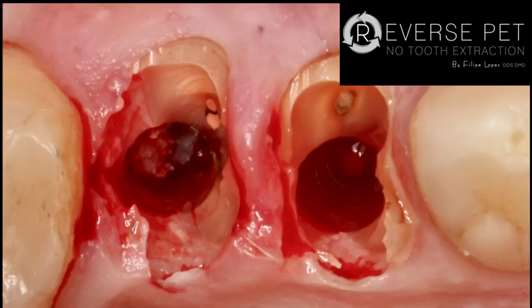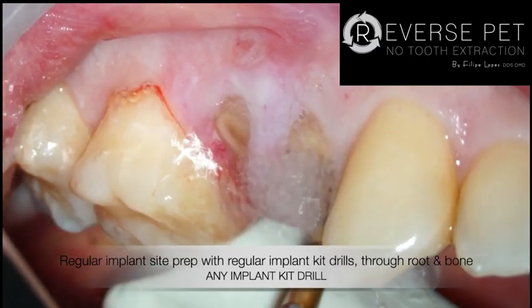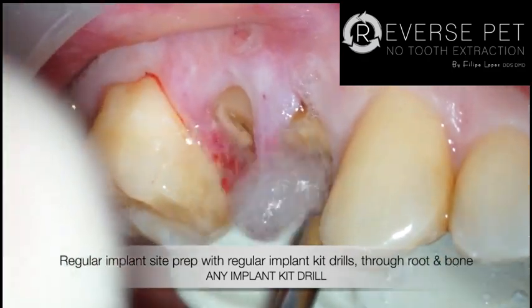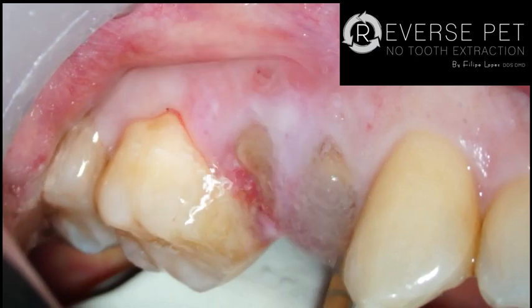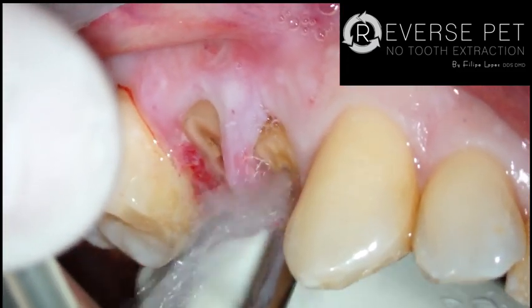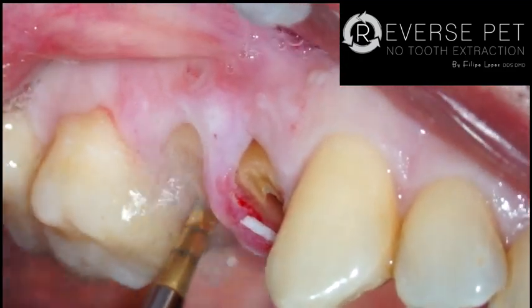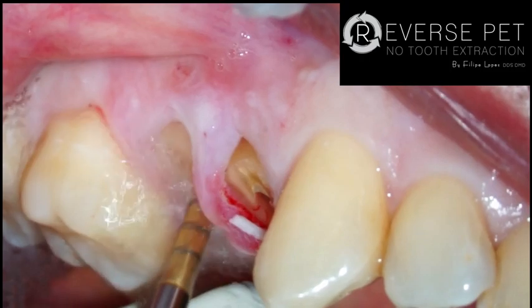Next thing we're going to do is go on with our implant site prep. Now I am using regular drills, okay, and I'm preparing my implant site as if the tooth was bone.